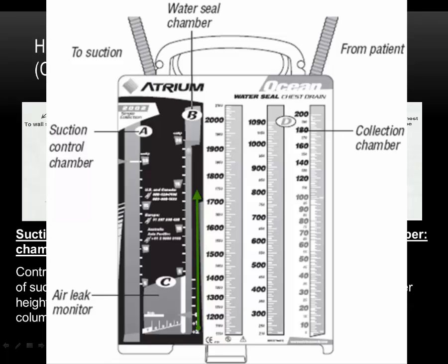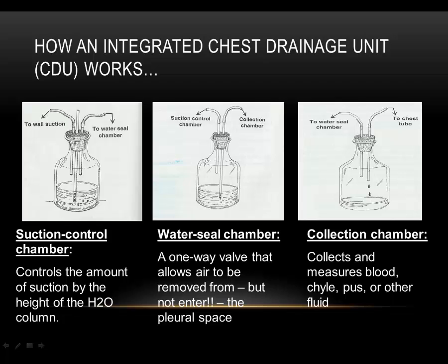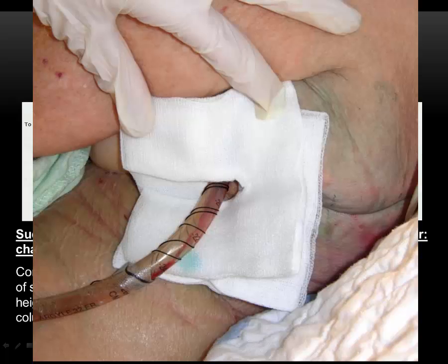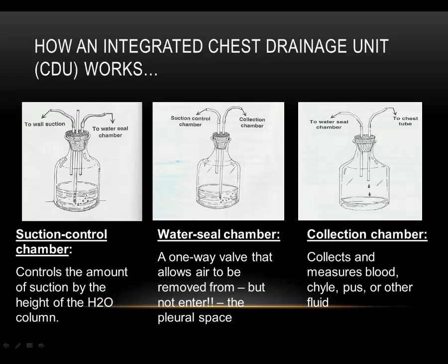After chest tube insertion, connect the tube's distal end to the CDU. Secure the tube at the insertion site with sutures. Apply an occlusive, sterile petroleum gauze dressing around the tube. Then apply a dry, sterile split 4x4 dressing over everything. Secure all tube connections from the chest tube to the drainage container using either tape or zip ties. A post-insertion x-ray confirms tube position and lung expansion.